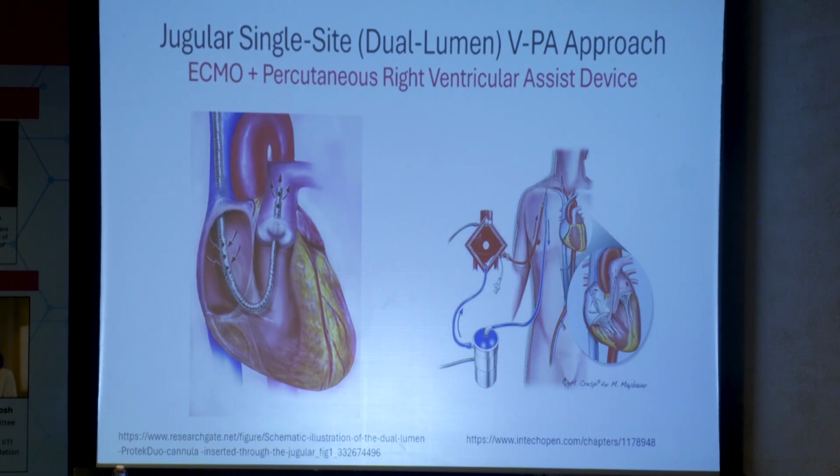We talked about most deoxygenated blood goes into the pulmonary artery. Yeah, so this essentially is a form of right ventricular assist device because it's not bypassing the heart, but it is bypassing the right ventricle. And so you are pumping blood under pressure into the pulmonary artery. You are supporting the right heart and increasing the pulmonary blood flow directly, whereas all those other strategies that I talked about before, you're taking blood out of the venous system and putting it back into the venous system before you get to the heart. Therefore, you're not providing any net change in flow in the heart itself.